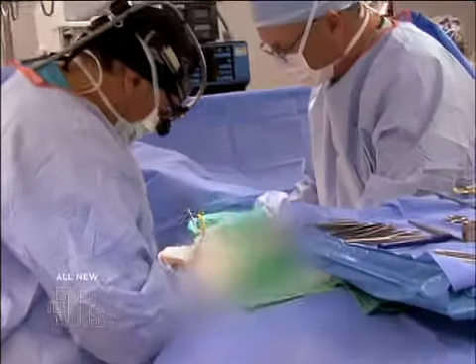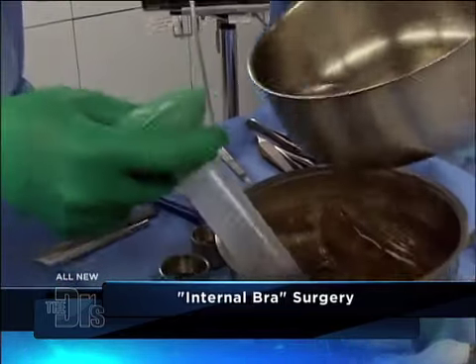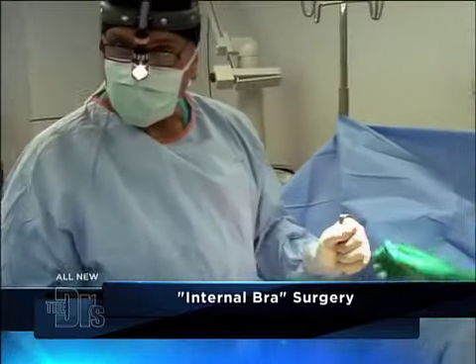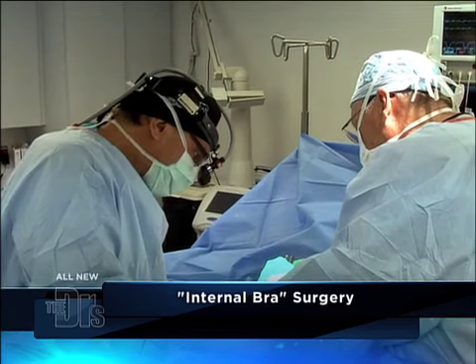It's showtime. So the first maneuver here, I am going through breast tissue — I'm looking at the rib cage. We put in sizers; that does a couple of things. Most importantly, it helps us decide on size. This gives us a sneak preview of what our lift is going to accomplish.